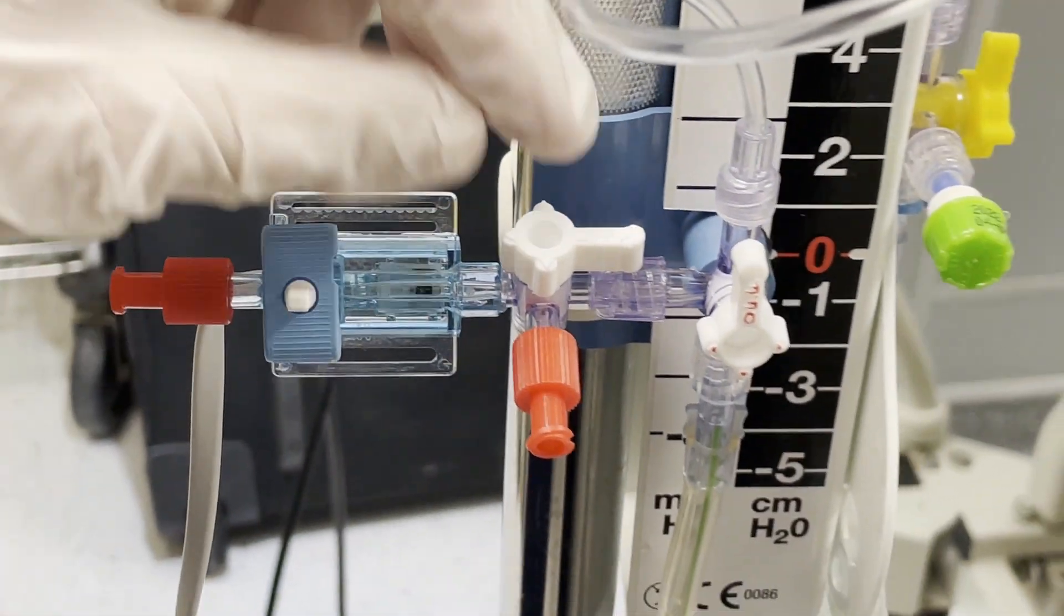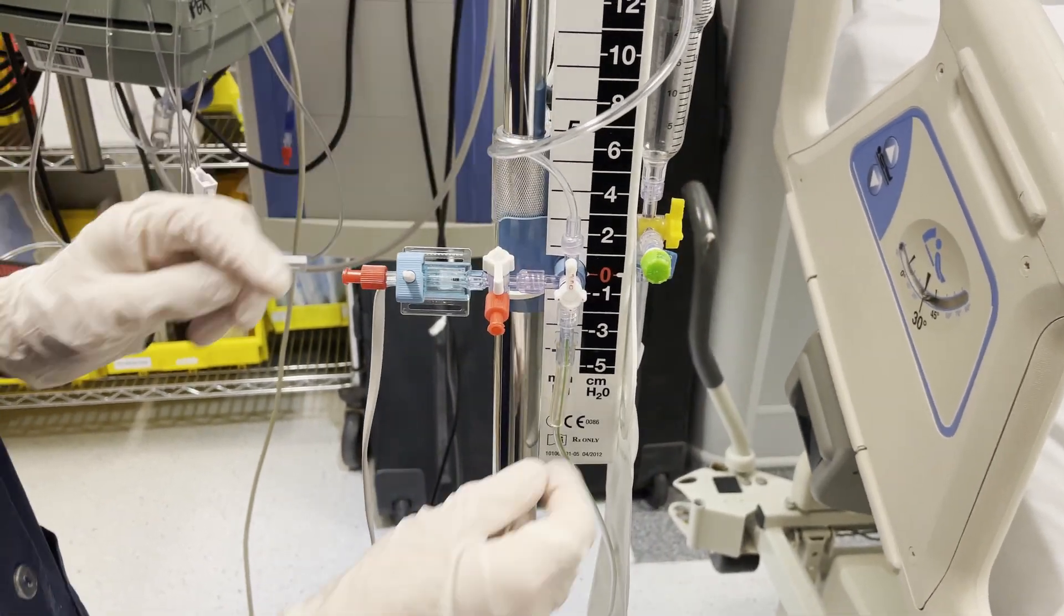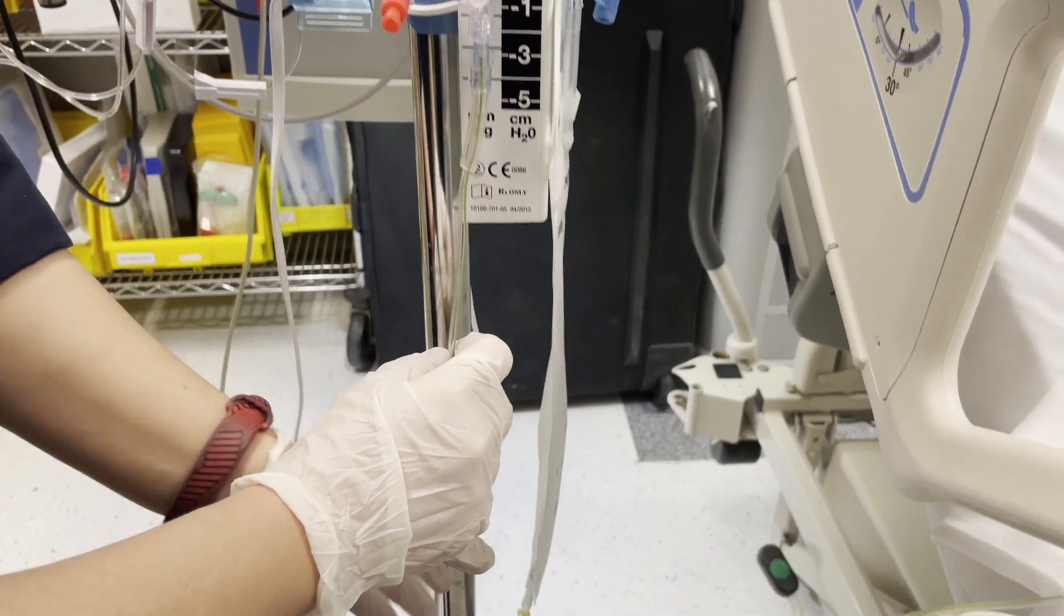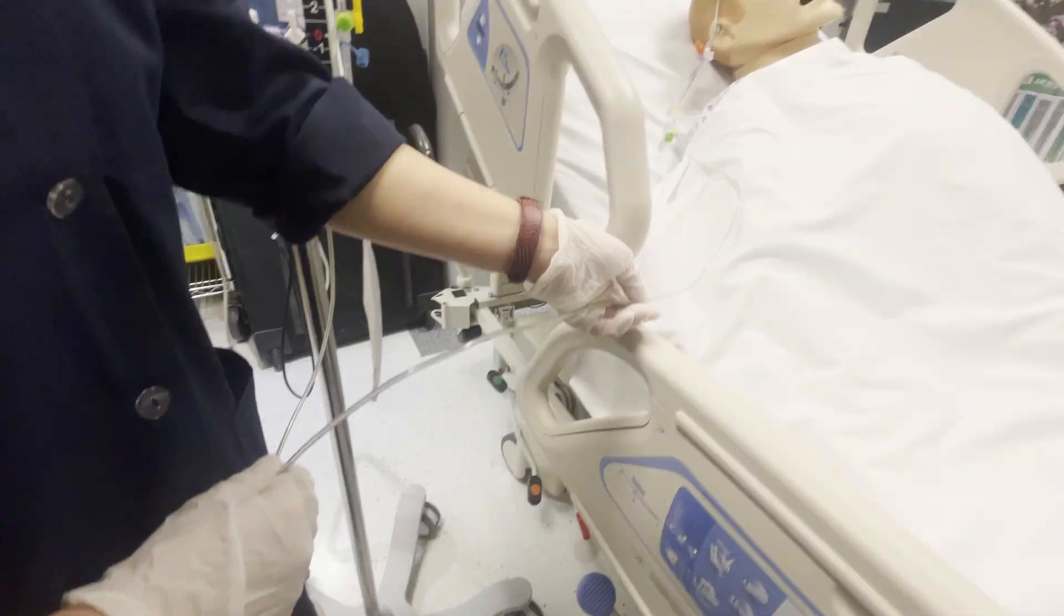Now you can open the relationship between the patient and the transducer. So the relationship now is open between the transducer which is connected to the monitor and the patient himself.